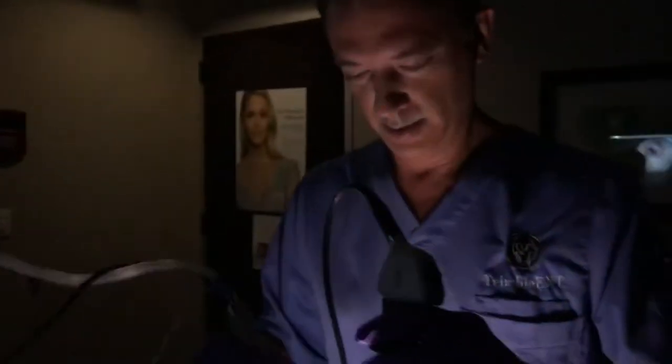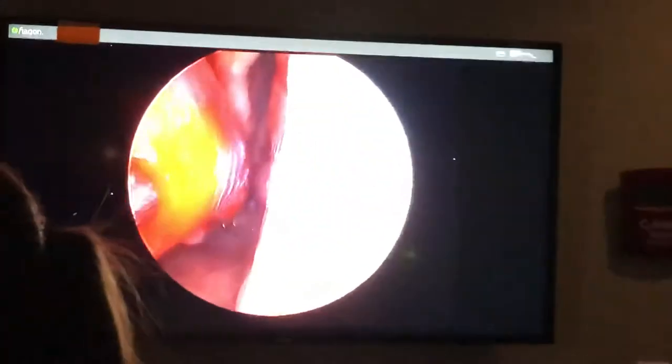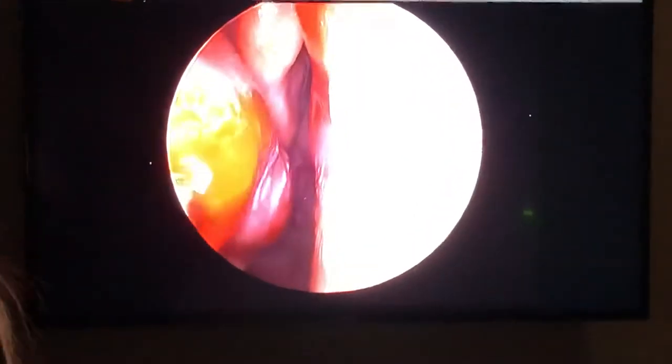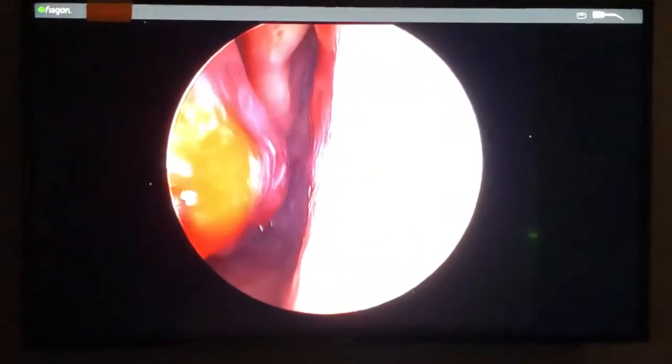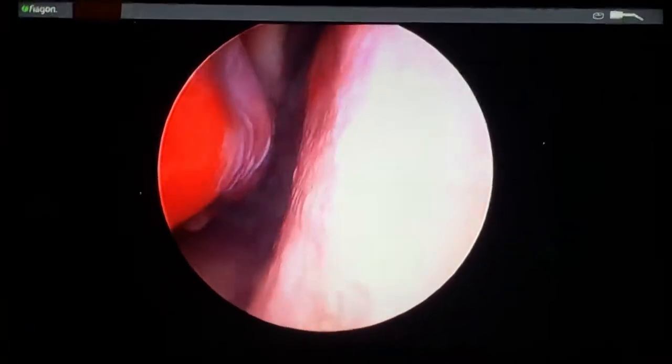So what are we doing here? We're doing inferior turbinate reduction with a 2mm micro-debrider blade — almost like a liposuction on the turbinate. This lovely patient breathes better.